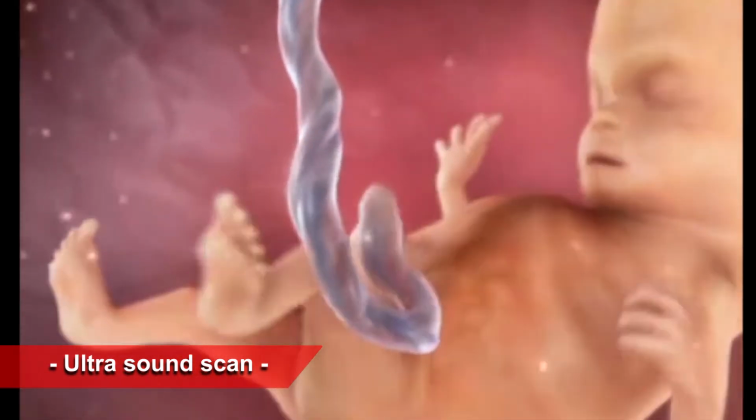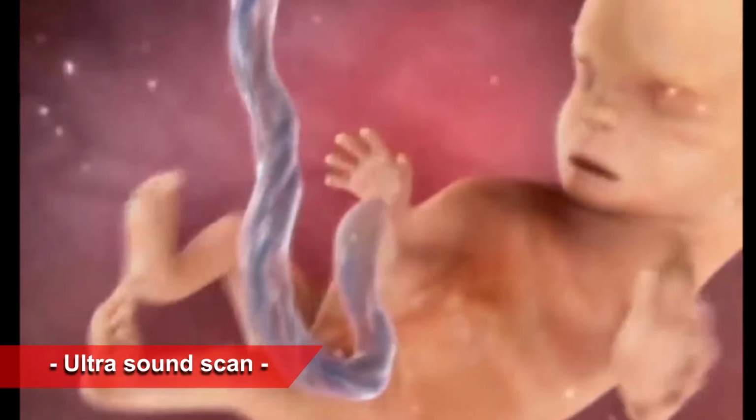But this number 4 is not fixed, because if conditions arise like decreased fetal movements, bleeding, or brown discharge, in those situations we have to depend on scans irrespective of a normal scan earlier. So usually, if it goes uncomplicated, 4 scans will do.